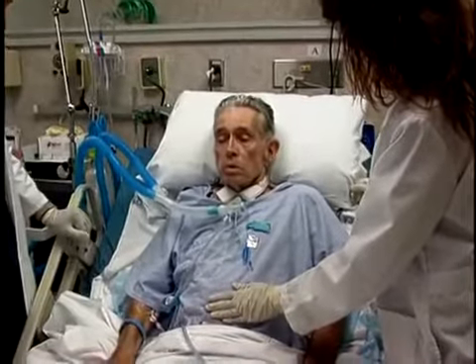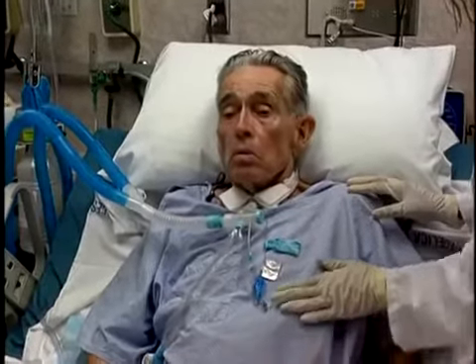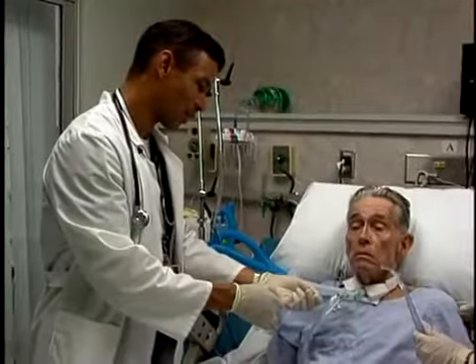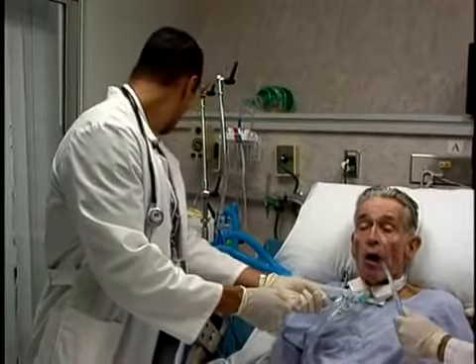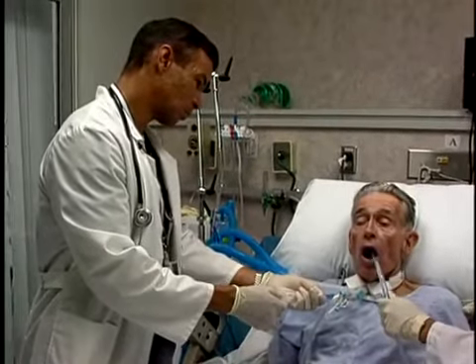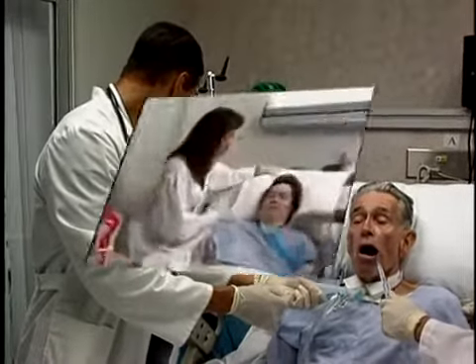Airway patency plays a significant role in tolerating valve placement. If the patient is unable to exhale adequately through the upper airway, remove the valve and reassess the following. Make sure the cuff is completely deflated. Evaluate the size of the tracheostomy tube. If it is too large, suggest downsizing to increase airflow around the tube. If the tube has a cuff and it is no longer necessary, suggest changing to a cuffless tube.